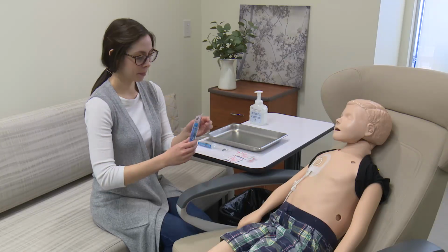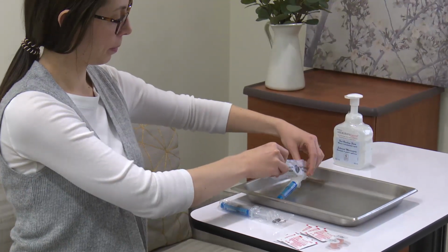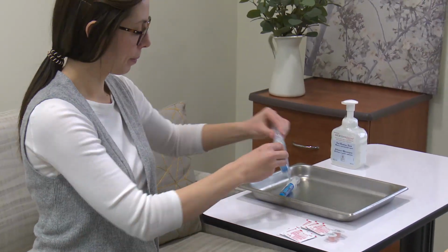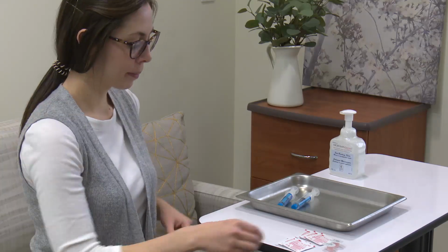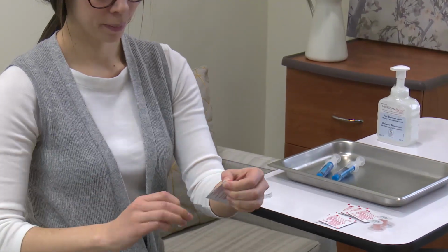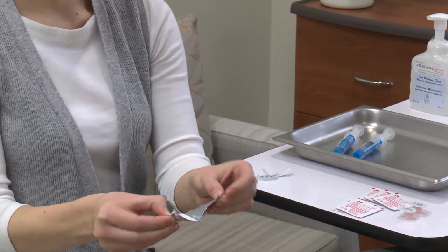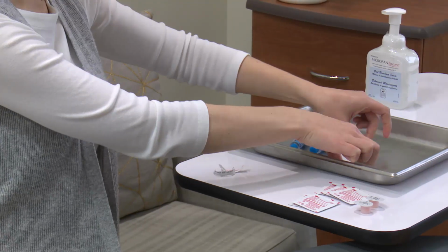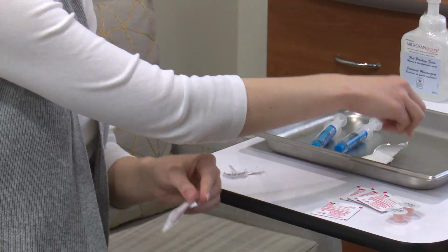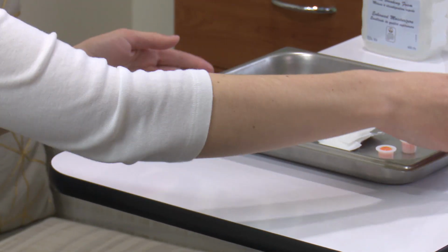Prepare the supplies on the clean work surface. Starting with the heparin, open the package and place the heparin syringe onto the work surface. Open the first alcohol swab by tearing 3 sides and opening it like a book. This way you can stack the other swabs on top of each other. Open the swab caps and keep them in the package. Add them to your tray.